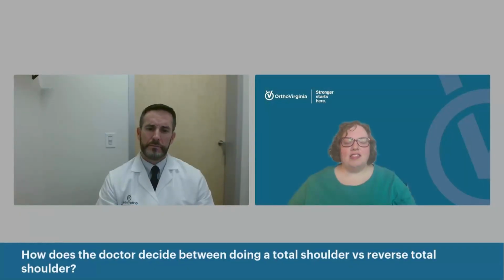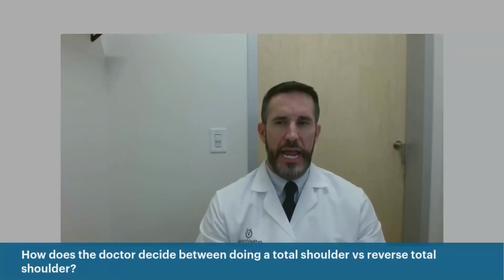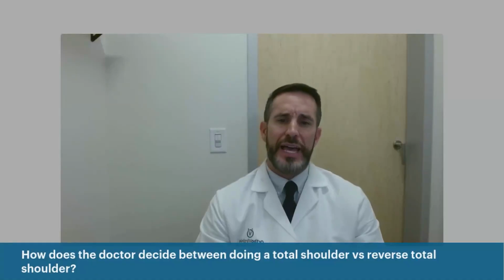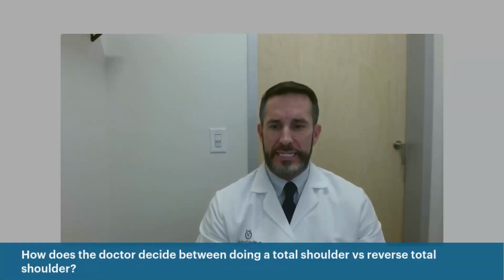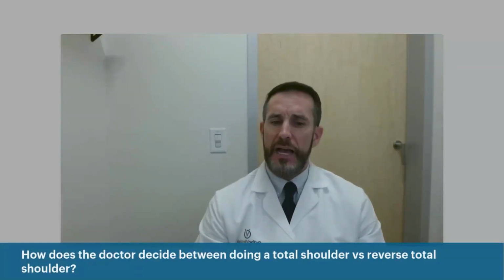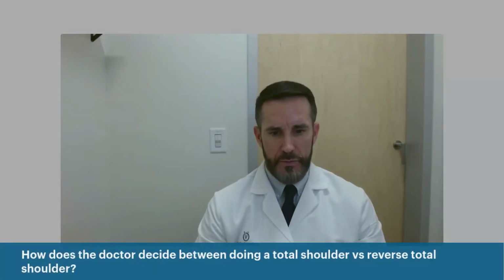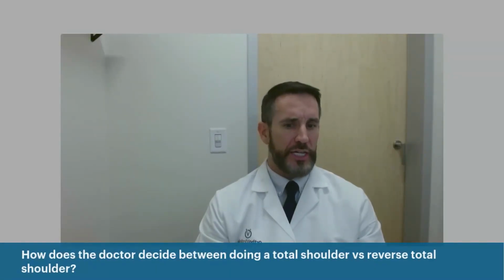Thank you. How does the doctor decide between doing the anatomic and the reverse total shoulder replacement? Yeah, so the simple answer to that is if it's determined, either historically, clinical exam, X-ray, CT imaging, MRI imaging, a combination of factors, that the rotator cuff tendon is not intact, or it's clear they have a large to massive chronic tear, an anatomic total shoulder replacement will not function well in that scenario. So those particular patients are excluded.